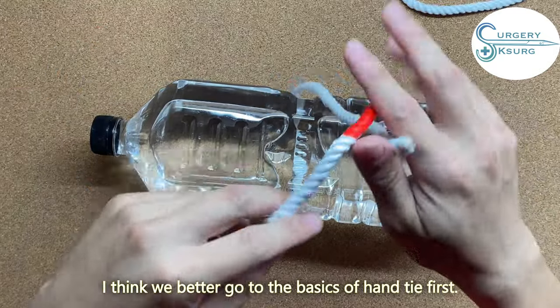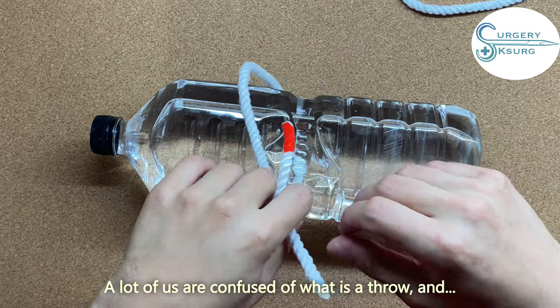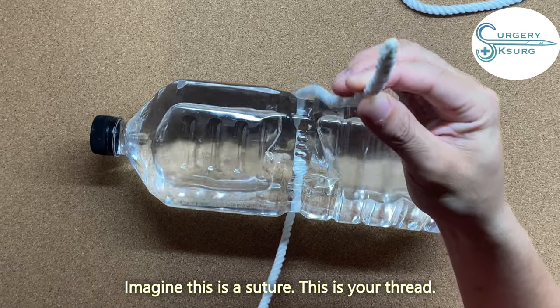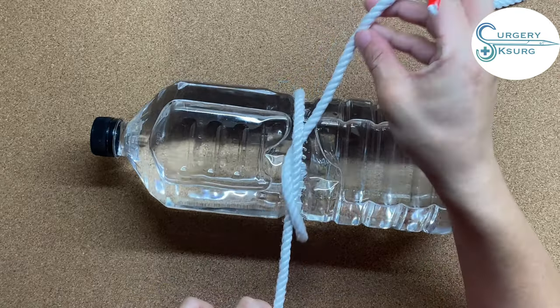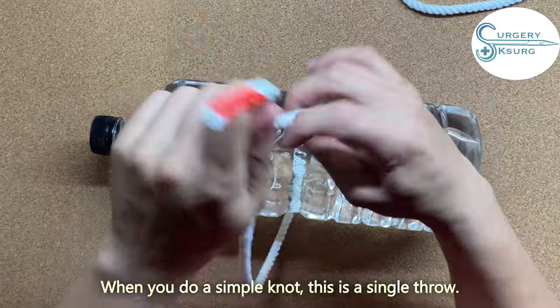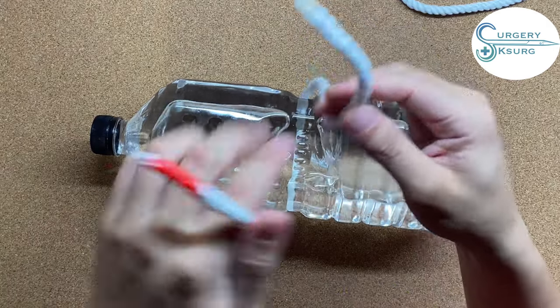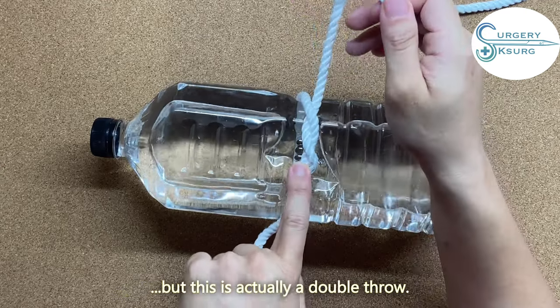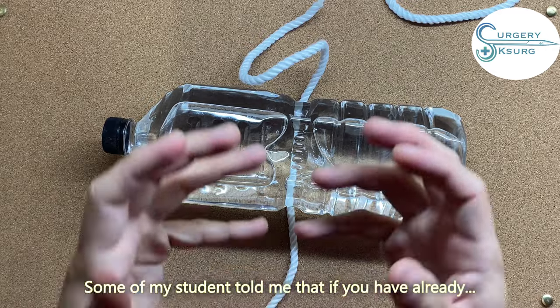Let's go to the basics of hand-tie first. A lot of us are confused about what is a throw and what is a loop. Imagine this is a suture — a thread. A loop is when you do this. And what we call a throw is when you do a simple knot — that's a single throw. When you do a surgeon's knot, that is a double throw. So one throw equals one loop.